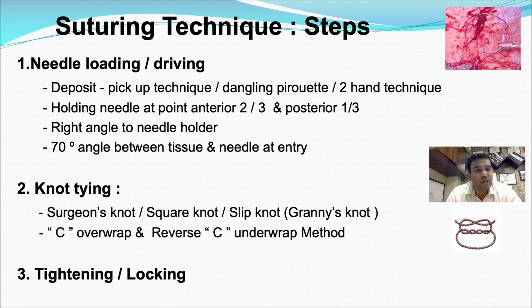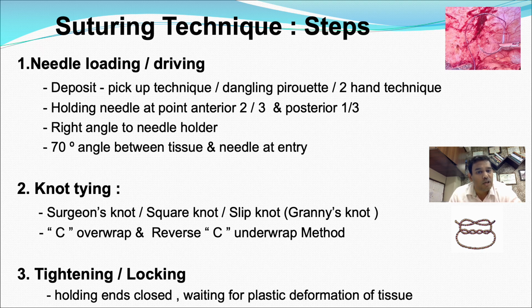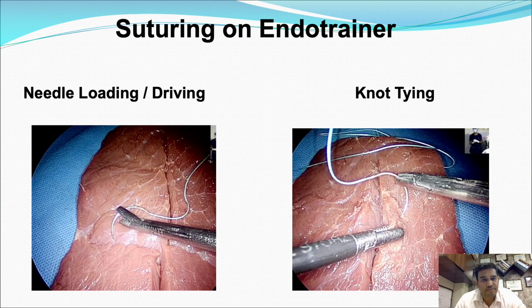Knot tying. You have a choice of surgeon's knot or a square knot or a slip knot, that is granny's knot. And there is something called a C and a reverse C pattern that I will demonstrate in the video. Third is tightening or locking the knot. You should hold close to the stitch line, I mean the sutures, to tighten the knot and wait for the plastic deformation, the permanent deformation you can see in the tissue, and then you can release the tension.